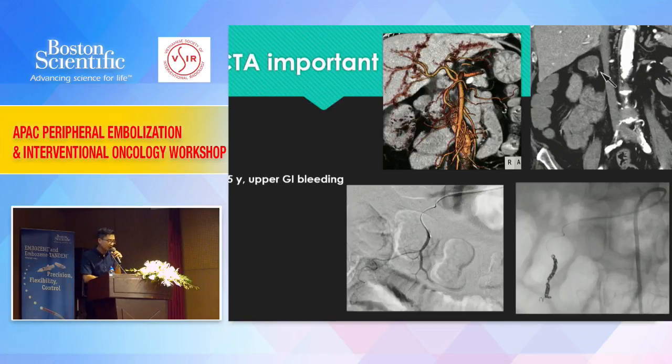CTA is very important before intervention. When the patient permits, we can do CT scan for good planning before the procedure. For example, this patient has active bleeding.